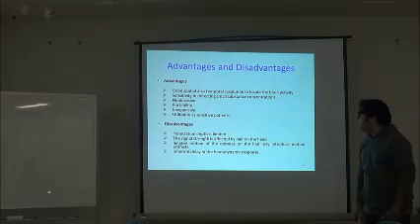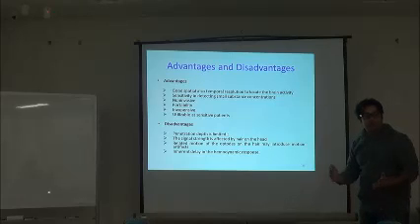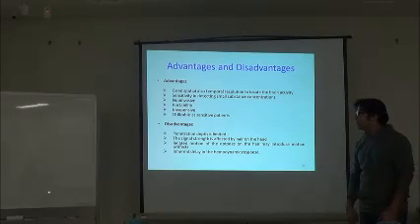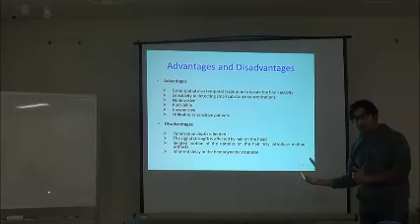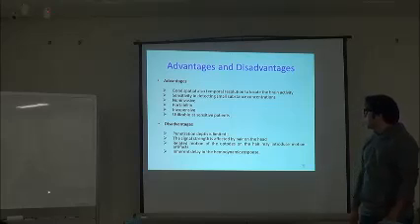So to locate the brain activity, it's a good thing. It has a balanced spatial and temporal resolution. Not as good spatial resolution as fMRI, not as good temporal resolution as EEG, but the balance of both.